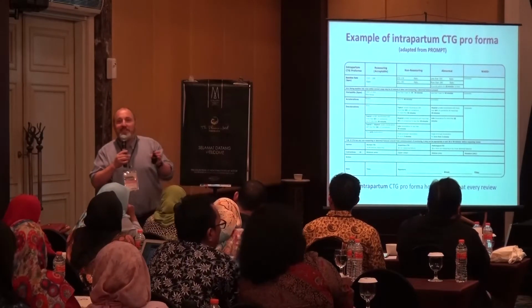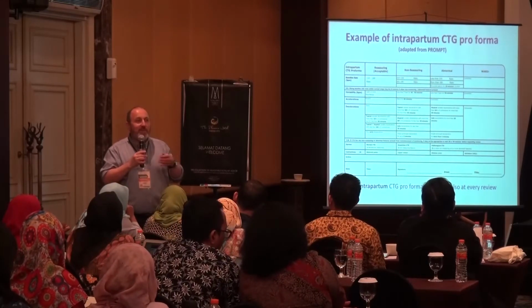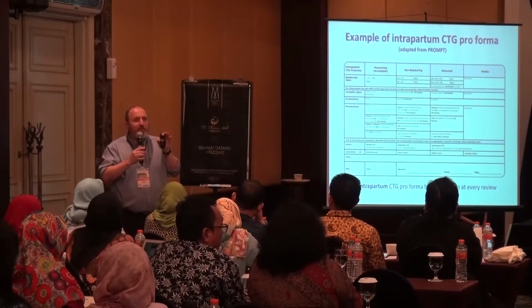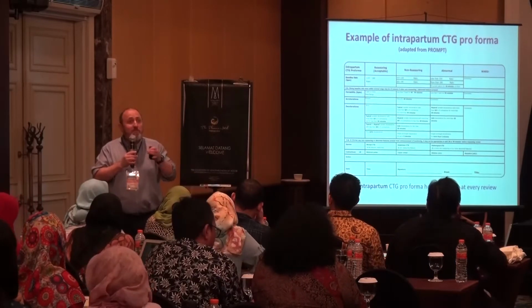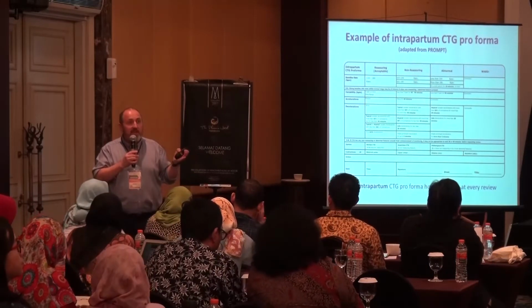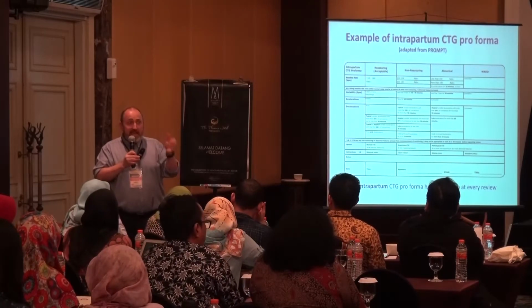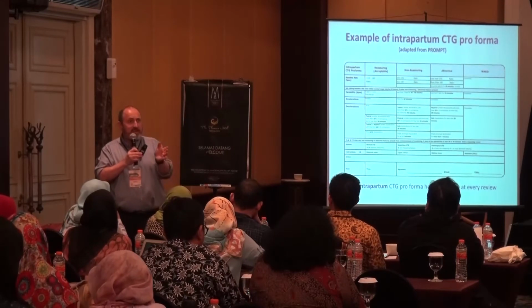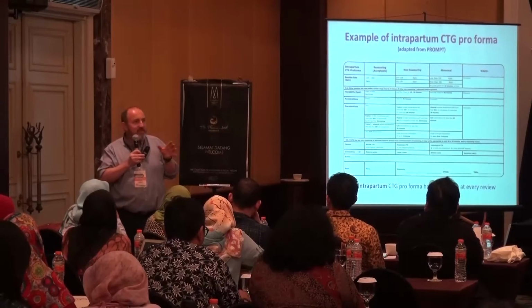And it stops this memory test. I think part of the problem with our use as clinicians of these guidelines to their full extent for fetal monitoring has been that you have to remember all these things. Variable decelerations, okay, is it typical or atypical? If it's atypical, it has to be for more than 50% of the contractions for at least 30 minutes to make it non-reassuring. It just starts to get really difficult.